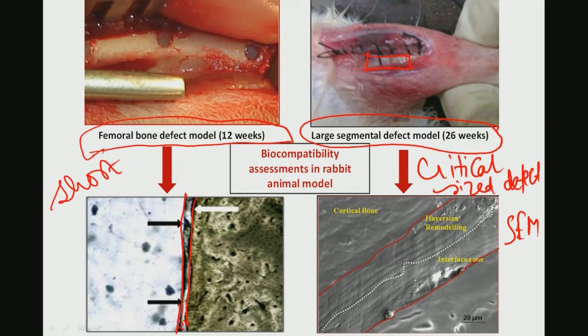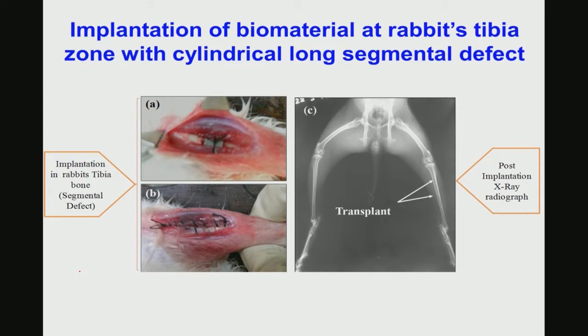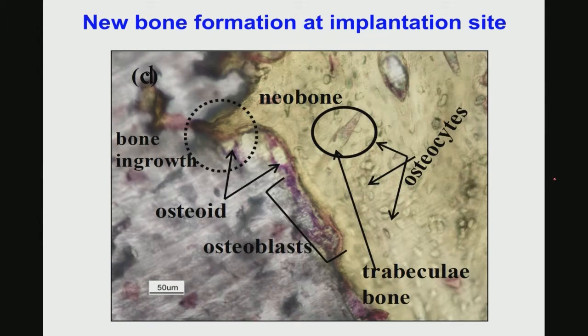In both the cases you see that there is neobone generation, and you can see Haversian remodeling, and this is clearly shown at the interface zone, and this is your cortical bone, that is the host bone. Here also it is cortical bone, and then another part is your implant. This is the case of implantation in the segmental defect model. Here you can see that it is placed with sutures and so on, and this is how the implant looks in the X-ray radiograph in the rabbit model.